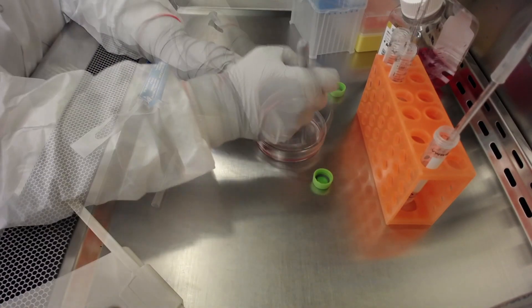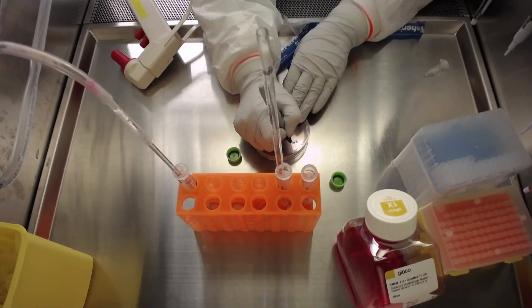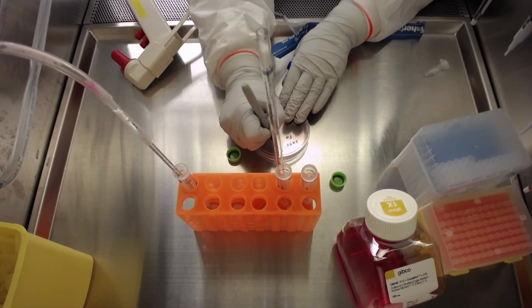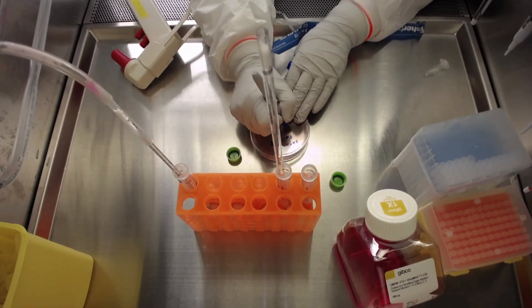It is important to clearly label your dish with relevant information such as the cell line name, date of plating, type of media used, and any other information you deem important.